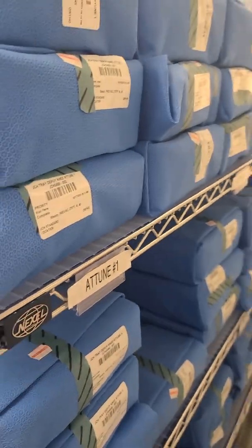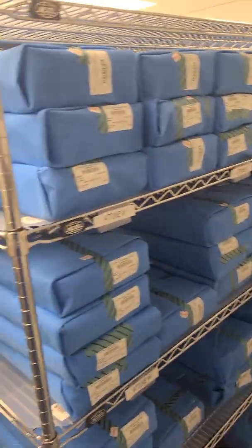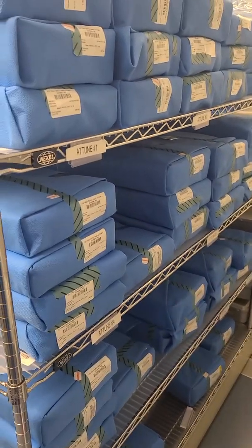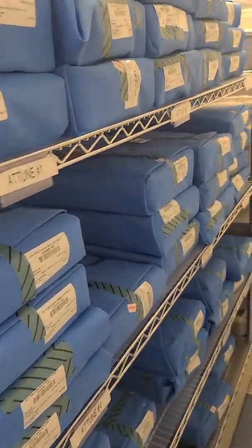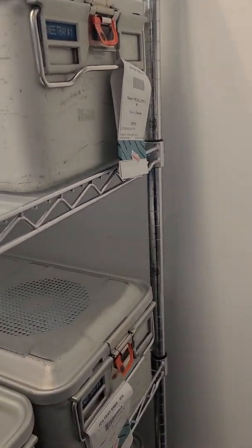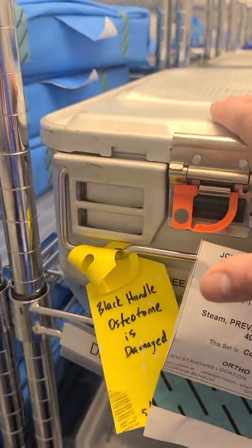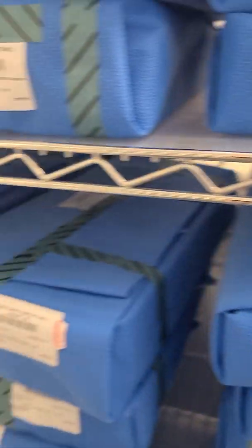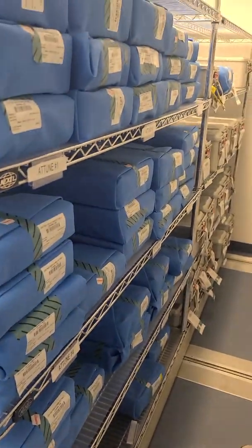In my opinion, this is the beginning and the end — the life cycle of an instrument. You can't use something without it being stored somewhere. Some argue this is not the beginning once it goes to the OR, but if this area becomes compromised, it's CSP's responsibility to reprocess all these trays. If the sprinkler systems go off, or it becomes so humid that sterility is compromised, or the area is dusty, or a lock is popped or missing — those items have to be reprocessed.